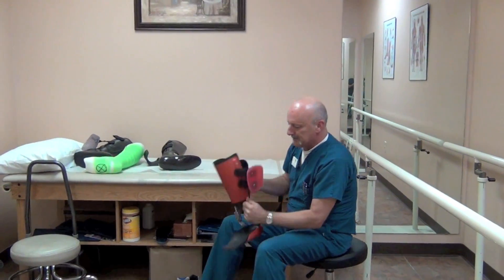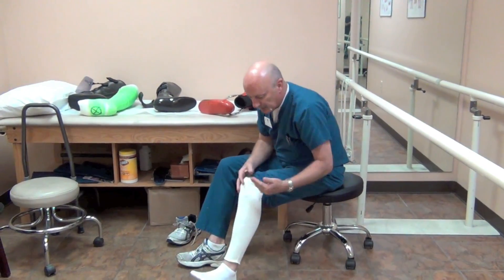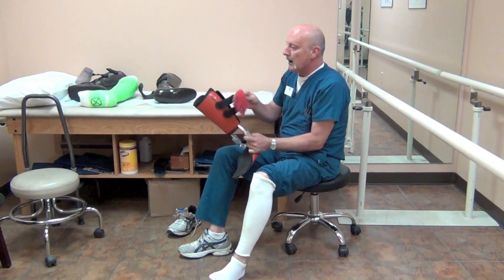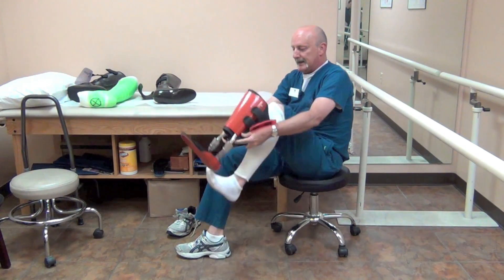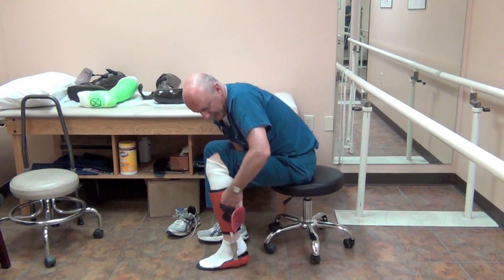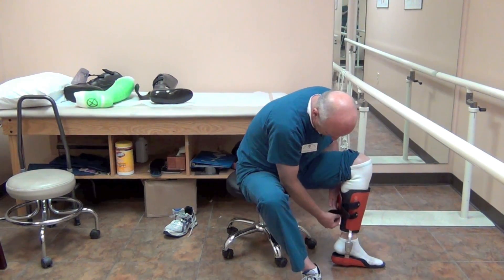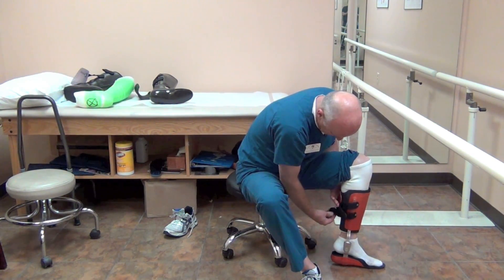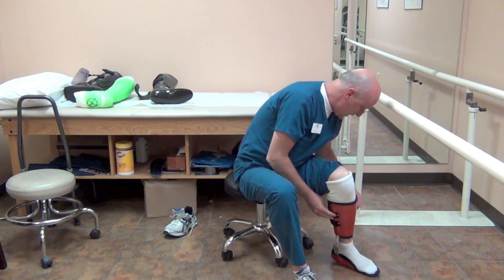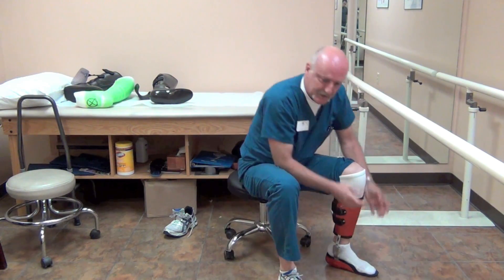When fitting, I recommend you fit the patient with a prosthetic sock — three or five ply. The Knit-Rite stretch sock is good; medium fits just about everybody. Cut the distal end off, and you have something to cushion the calf and ensure a tight fit. The patient elevates the heel, wraps the foam around their leg, puts the plastic back there, and then does their Velcro straps — necessarily tight. The bottom strap you want pretty tight; the top one doesn't have to be super tight. The pressure is very tolerable because it is spread over a very large area.